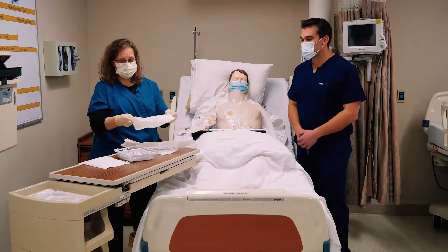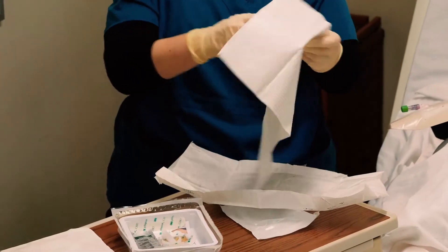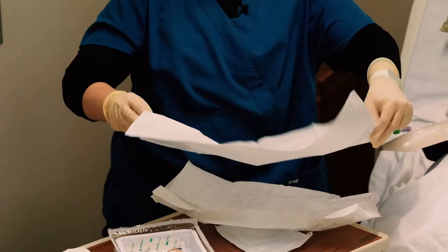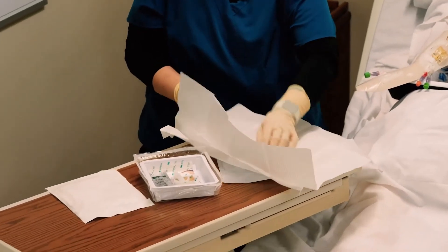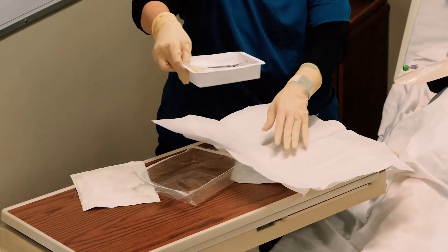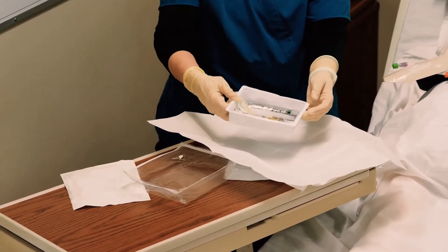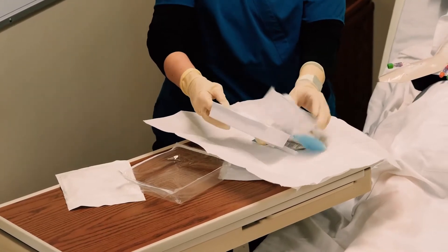Setting up a sterile field means I can bring any of this stuff out. The inside of that whole tray is sterile — I can place it down here in the middle, or dump it all out if I wanted to, so I can tell exactly what's in it.